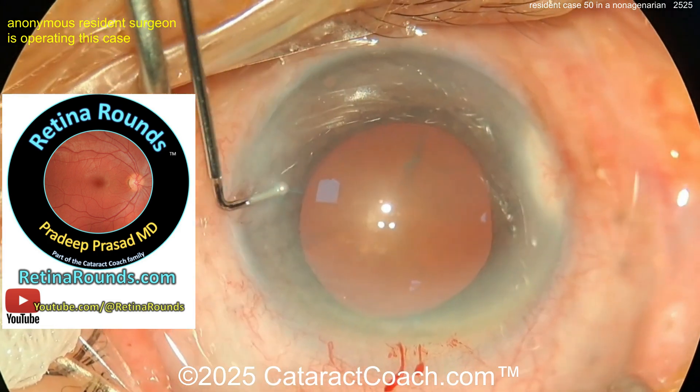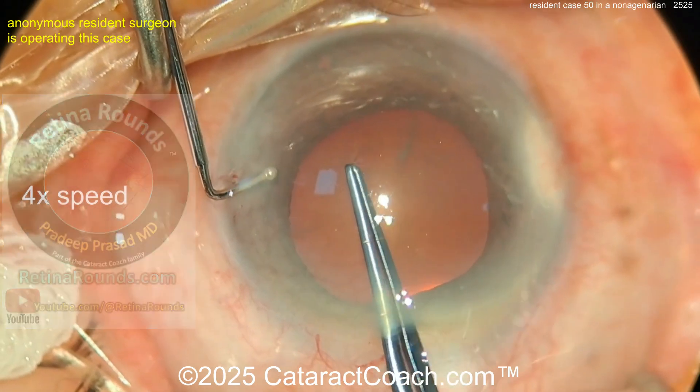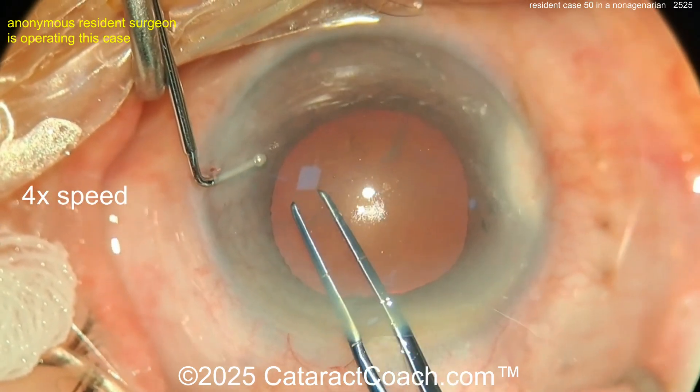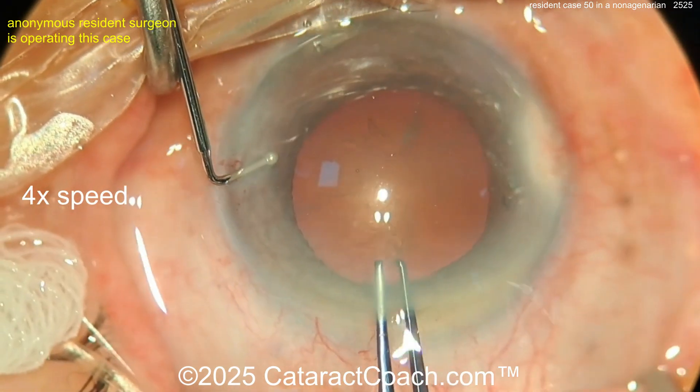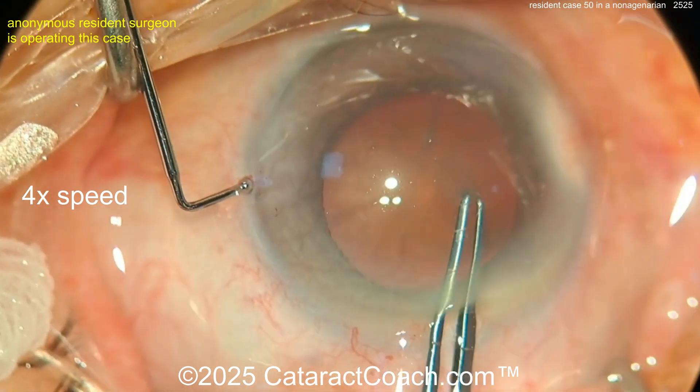Did I tell you about RetinaRounds.com, our surgical channel for retina? You're going to learn a lot — if you're a resident you should check it out even if you're going to specialize in cataract, glaucoma, or cornea. Now getting the rhexis done here.